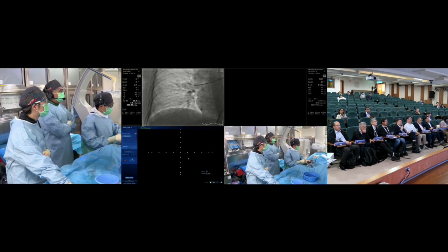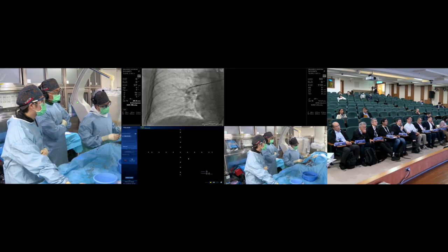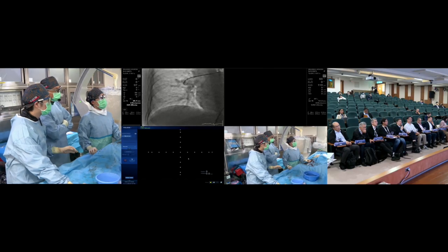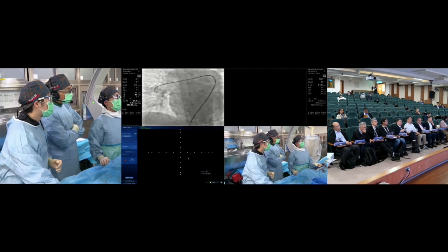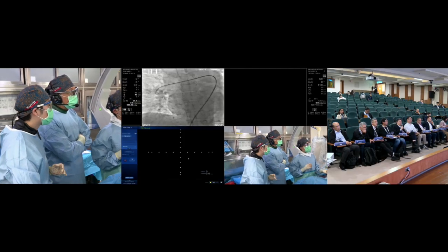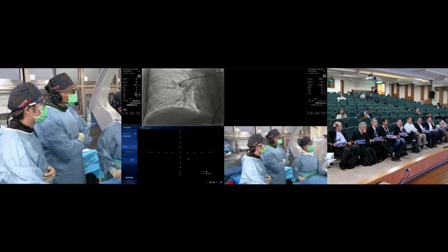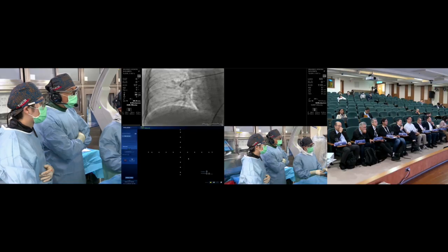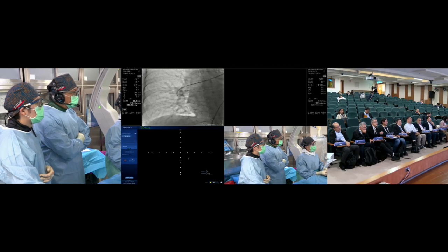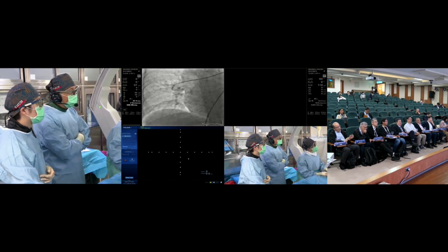Should we advance the long sheath into the right pulmonary artery, not the main pulmonary artery, for better support? Because this long sheath right now is not able to. We have to use a longer long sheath, a 65 long sheath, because it will prolapse and protrude into the left PA.